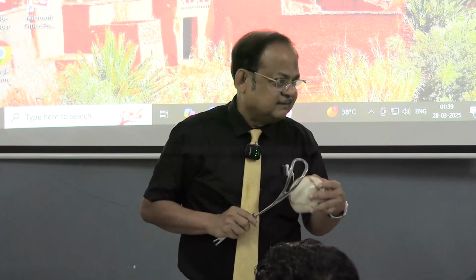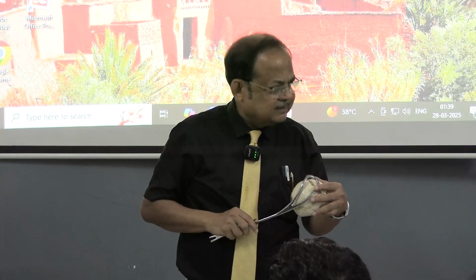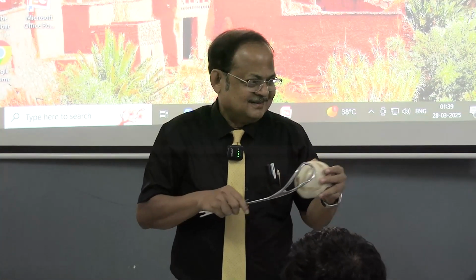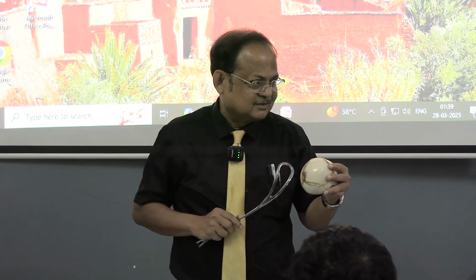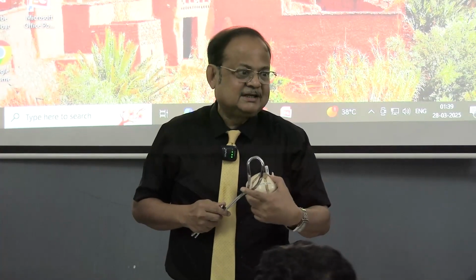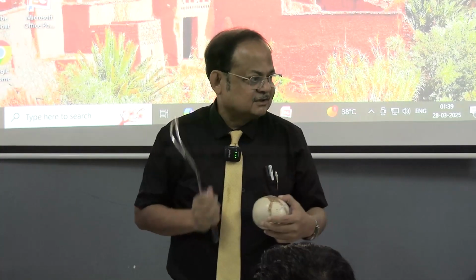Originally, the solid blade was used in many countries, but the disadvantage of the solid blade is slipping. The advantage is that no maternal soft tissue injury occurs. That is why the pseudo-fenestrated blade was made: the inner side is fenestrated, but the outside of the blade is solid. So there is no injury to the maternal tissue.